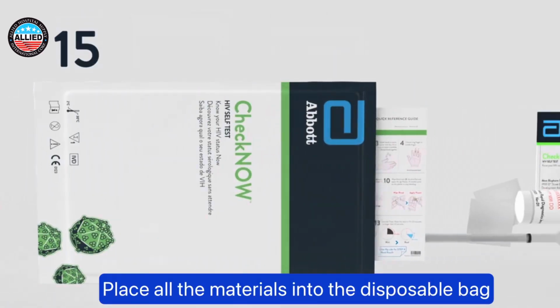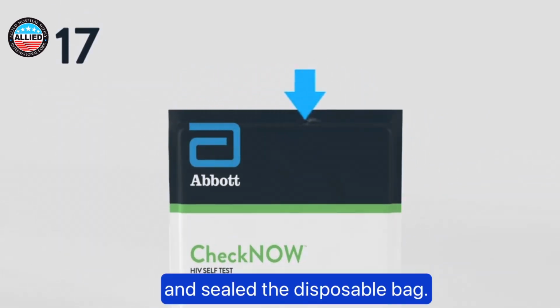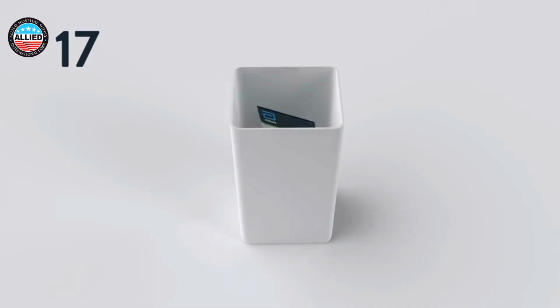Place all the materials into the disposable bag and seal the disposable bag. Dispose in the infectious trash can.